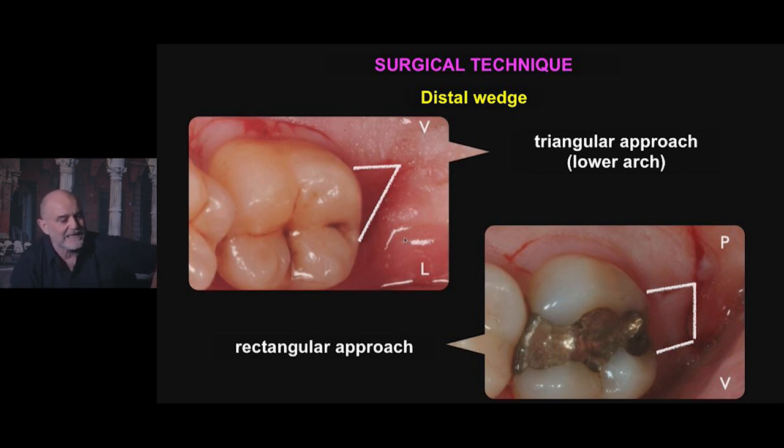In general, the distal wedge distal to the seventh in the lower arch is triangular shaped. This is already a compromise. At vestibular level, the horizontal incision continues.